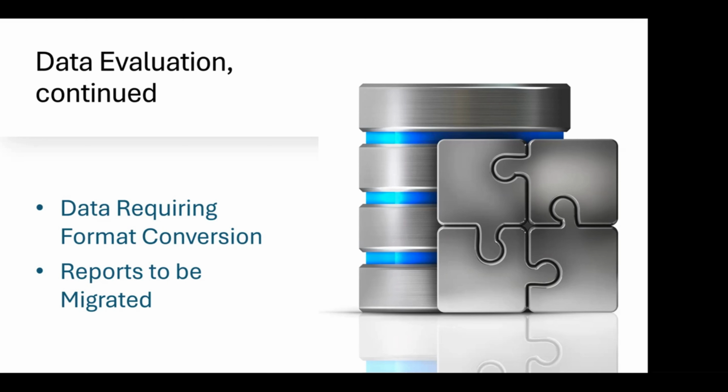The source system, which might be the EMR or the legacy PACS or VNA. The EMR is generally considered the source of truth, but when it was built, it may have only imported 7 to 10 years' worth of the most recent reports. So the legacy PACS database may be the only system you can actually get those older ones. The format of those reports has to be considered. In most cases, you can extract them from a database like the PACS database. But we've seen these, are you going to get them as a database record extract? Or are you going to get them as a push of ORUs to an HL7 feed? Are they stored as files? I've seen ones that store them as a file in RTF or Word format.